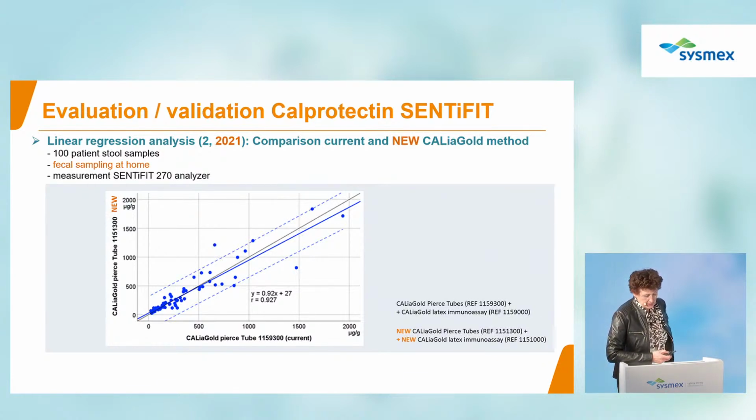So maybe it's time to start a study for the reference values and the methods for performing an endoscopy, which we are performing now, and the results are expected in June. And what we see is that the reference value will be a little bit up-leveled, and also the endoscopic cutoff value will be a little bit higher, we guess.